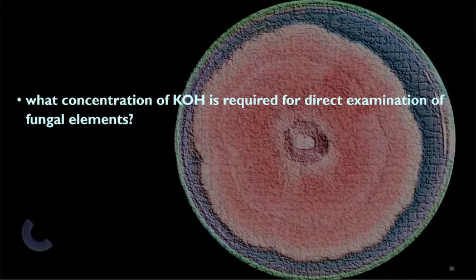But sir, I can't see the fungus. So, you will use KOH. Why can't you see the fungus? Because there are skin cells there. It causes problems with visualization. The skin cells, more or less, I would consider as a contaminant, because they block the actual thing that we are trying to see if you're using it as a saline wet mount, or if you're visualizing it using saline as your wet mounting medium.